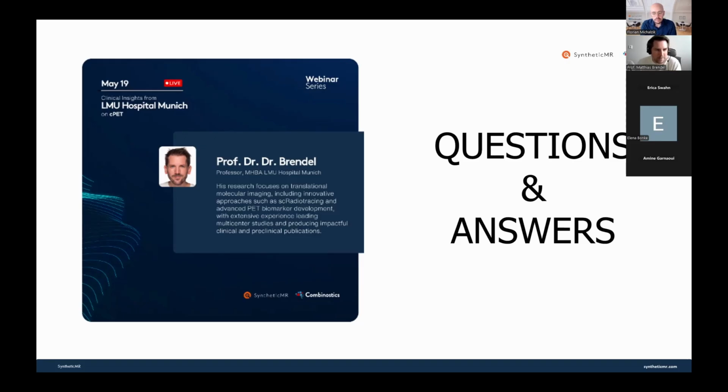Yeah, I think this is a very important question, and what we have learned clearly also from the phase 3 trials is that CSF monitoring is not really working. So we cannot judge if we are already successful with the therapy and if we removed all amyloid from the brain, but this can be done, as shown in the donanemab trial, by the centiloid quantification. And therefore I think this can even be cost effective.